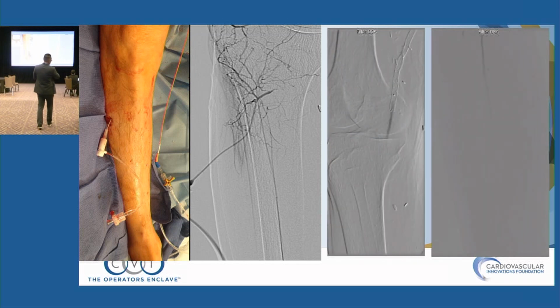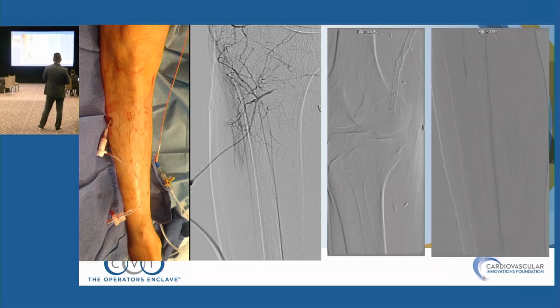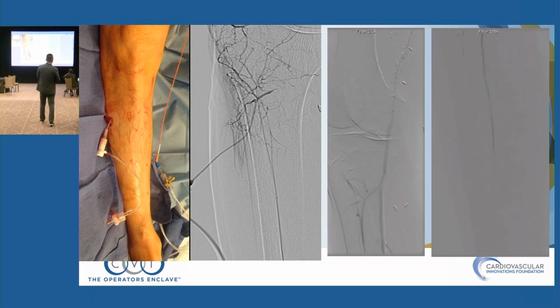High AT access is actually very easy to do. It's a very superficial artery at that point. This was actually a very good case, a long case, but just to show you, there's really nothing below the knee except this little island. I've only had to do this maybe twice, but it's very easily visualized by ultrasound. Poked this, eventually got up.